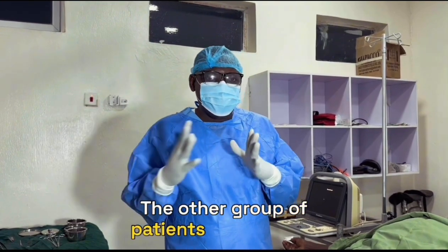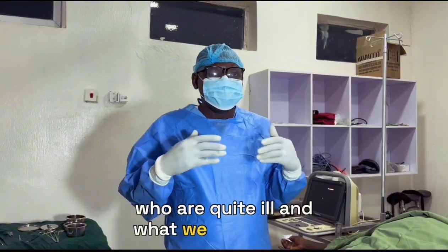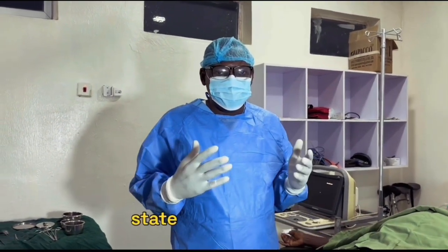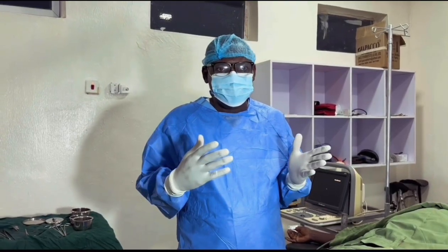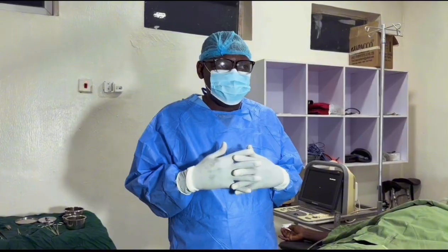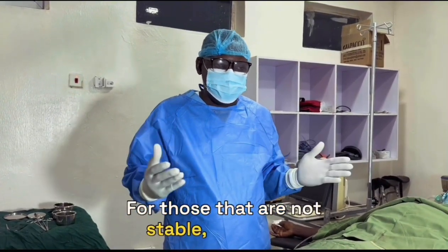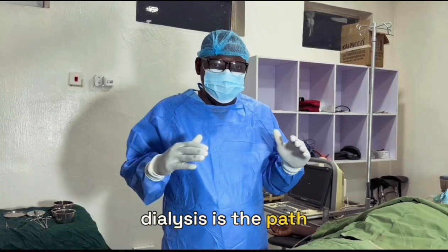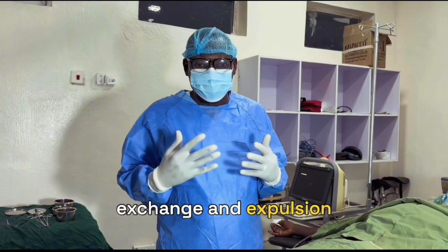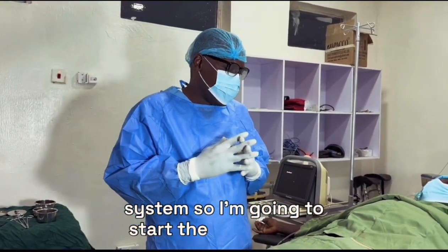The other group of patients are patients who are quite ill, and the state of health is not good enough for them to be on the machine. The machine requires a lot of stability for it to function. For those that are not stable, peritoneal dialysis is the perfect way to go for them to have exchange and excretion of the waste in their system. So I'm going to start the PD insertion.